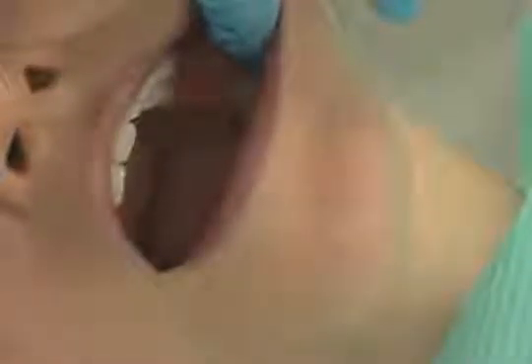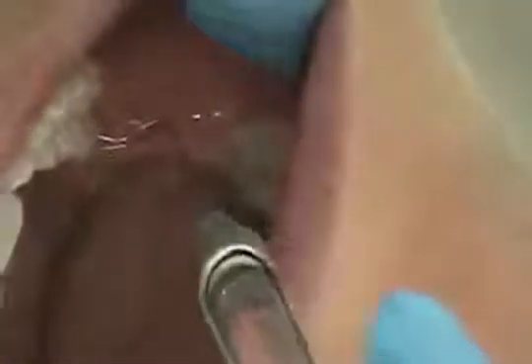The patient position is supine or semi-supine with the mouth slightly open. Operator position for the right is 8 o'clock facing the patient; operator position for the left is 10 o'clock facing the same direction as the patient. The landmarks are the mandibular molars and the mucobuccal fold. The syringe position is parallel with the occlusal plane on the side of the injection, but buccal to the teeth.